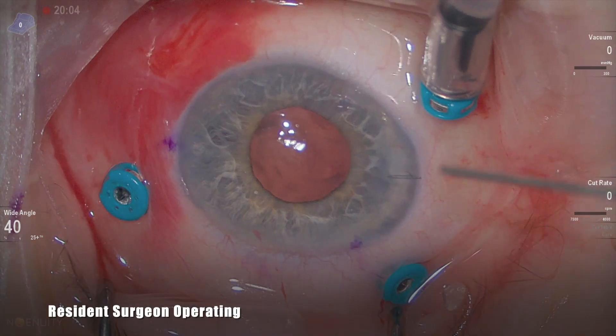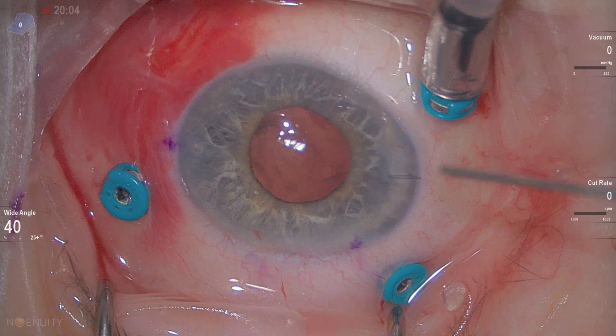Hi, this is a case operated by a resident surgeon. I'm helping the surgeon place an anterior chamber IOL after removal of a dropped nucleus. The wound has been enlarged to about 6mm and we're placing an MTA-5UO lens which is 13.75mm in diameter.